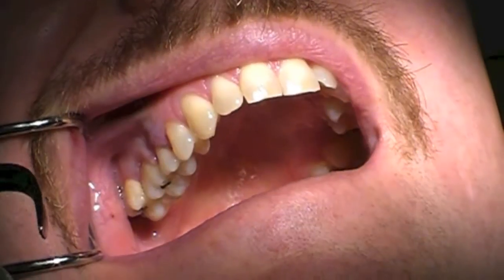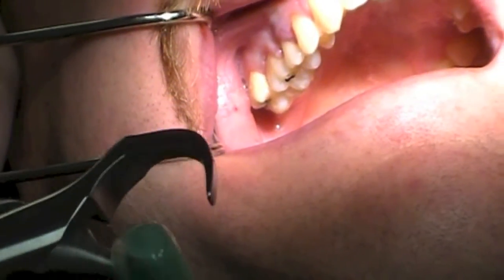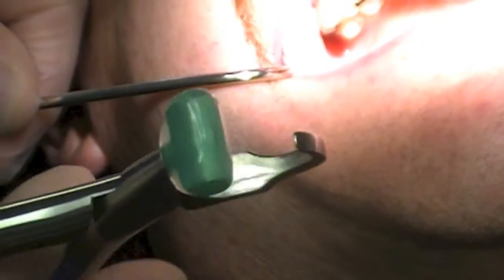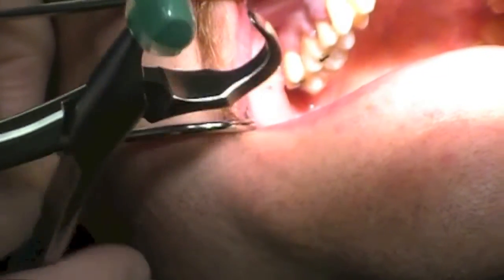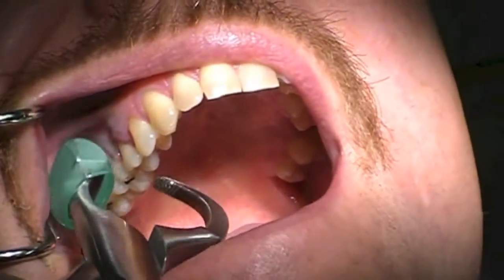The Physics Forceps, it has a green bumper on it. That bumper will be on the buccal or facial aspect of the bone as far up the vestibule as possible. The flattened edge will engage the lingual part of the tooth. Open big for me, sir.